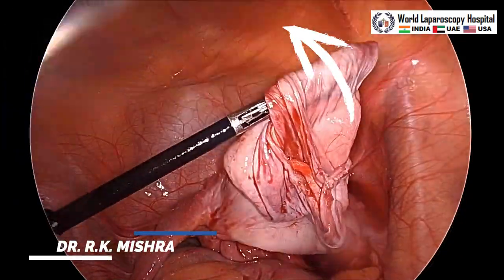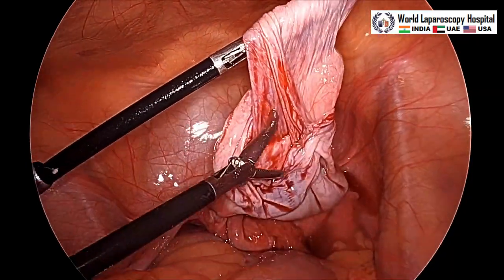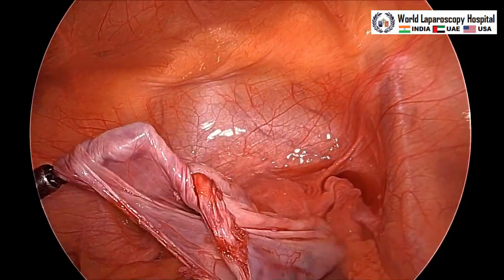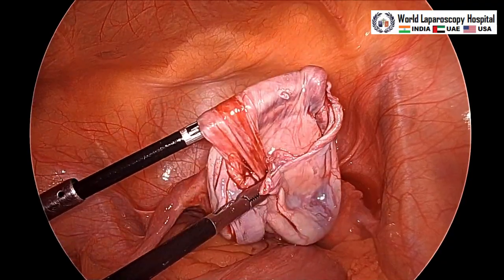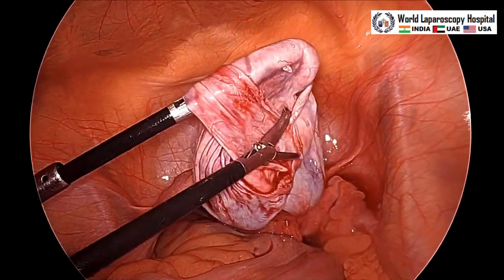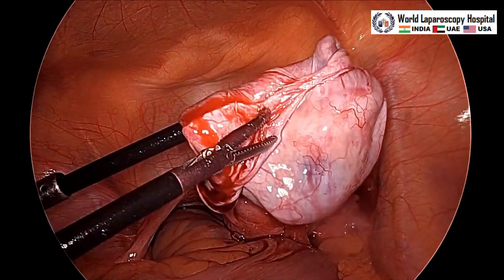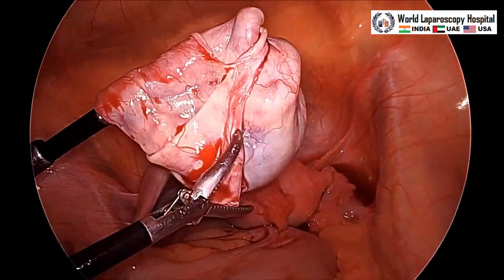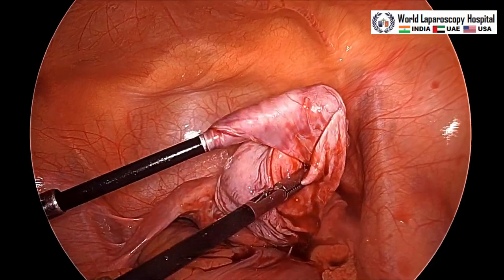This technique is very good to prevent the slipping of the cystic wall and to get the entire cyst separated from the ovarian cortex. Although you have to separate all around equally, slow wrapping on the left hand instrument will help you and then you can separate the entire cyst with a good plane of dissection. Again wrap and again separate the ovarian cortex. An ipsilateral port is required for this technique and separation is continued.